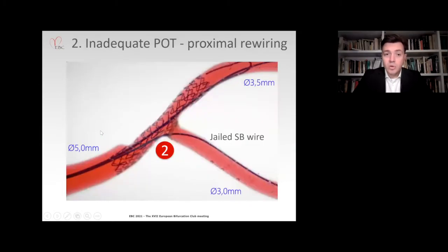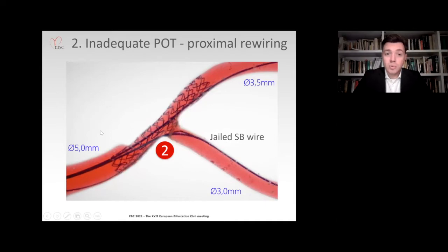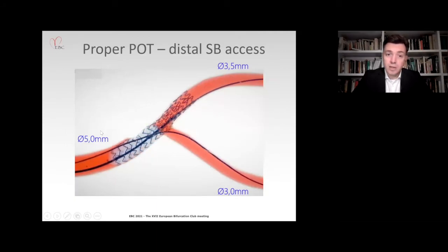Now let us focus on the more distal segment at the bifurcation core. If you do not perform POT, or if it is performed incorrectly, you will practically always aim for the proximal cell when trying to rewire the side branch, as you can see nicely here in this Bench test. This is not what we try to achieve with crossover stenting — we try to go as distal as possible when re-accessing the side branch. So how can we correct this and give ourselves a chance of distal side branch access? By performing proper POT.